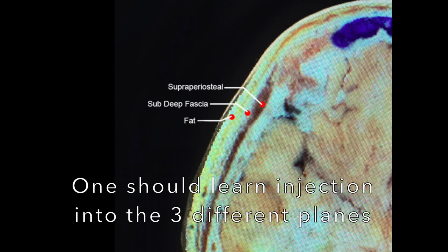There are three different planes for filler depositions. Some practitioners prefer one plane over the other. Personally, I inject into all three different planes, because of the aesthetic outcome I'm looking for. The injection plane depends on the condition of the patient that's presented to me at the time. It is a balance of risk versus results.